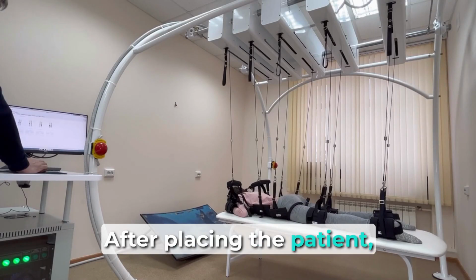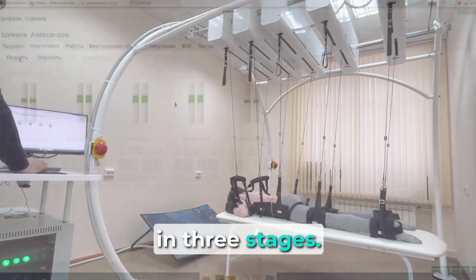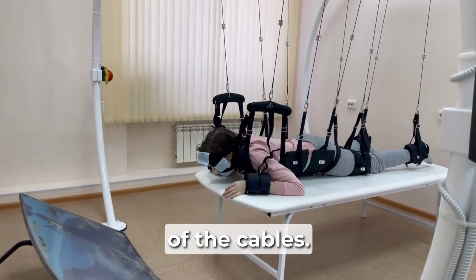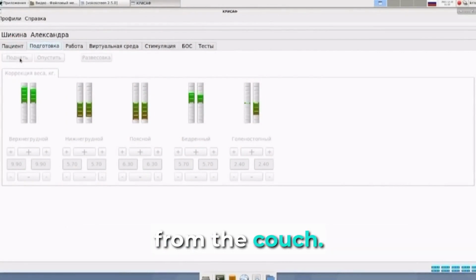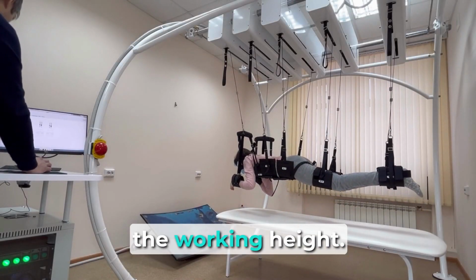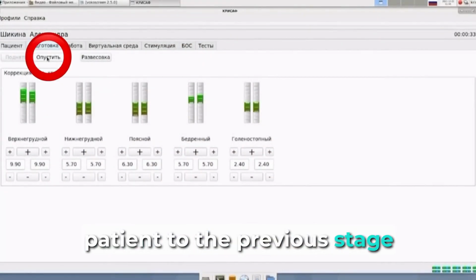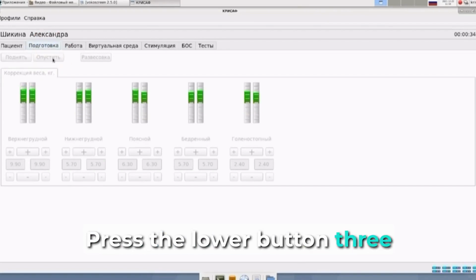After placing the patient, when the operator presses the lift button, the patient is raised in 3 stages. The first lift is pre-tensioning of the cables. The second is to preliminarily raise the patient 10 centimeters from the couch. And the third is to raise the patient to the working height. The operator can return the patient to the previous stage by pressing the lower button at any stage. Press the lower button 3 times to lower the patient.